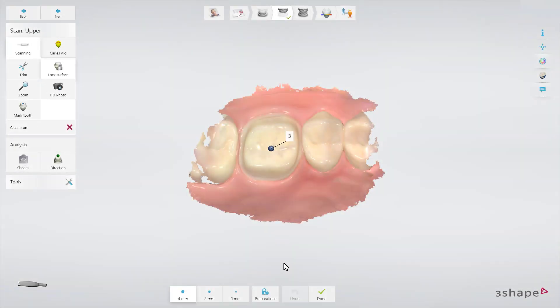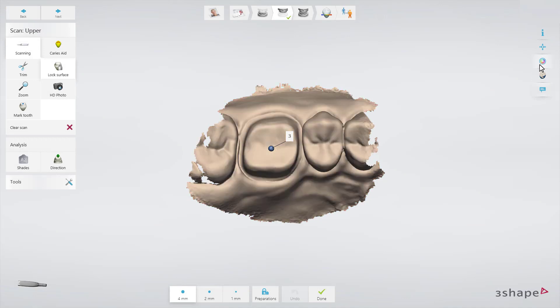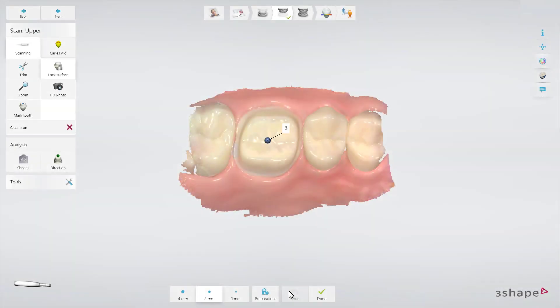You can also select Preparations, which locks a diameter around the marked tooth. It might be easier to see the locked area if you switch off the colour in the menu to the right. When the selected area is OK, click Done.